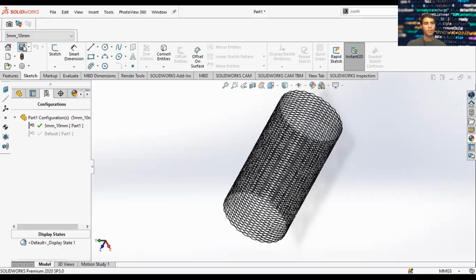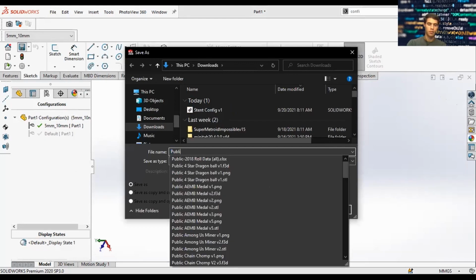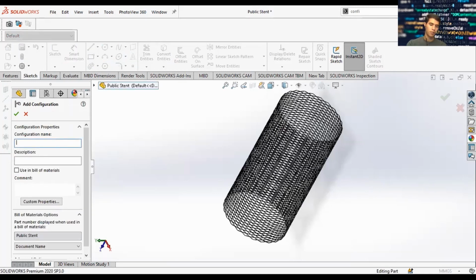Let's do a quick save. We're going to save this as part 1, Public Stent. So we save this part, and we have our first configuration, which is 5 millimeters, 10 millimeters. But this configuration is also the same thing as the default configuration. Nothing has changed. So let's add a new configuration that we can change some stuff to. Configuration name, 2.5 millimeters, 10 millimeter. So this is going to be 2.5 millimeters in diameter, 10 millimeter length.